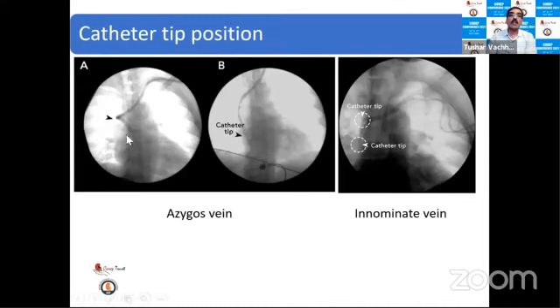Catheters, if placed blindly without fluoroscopy or X-ray guidance, may have the catheter tip enter abnormally enlarged veins like the azygous veins, and here again you can see that there's a big kink which can be easily corrected if recognized early enough.